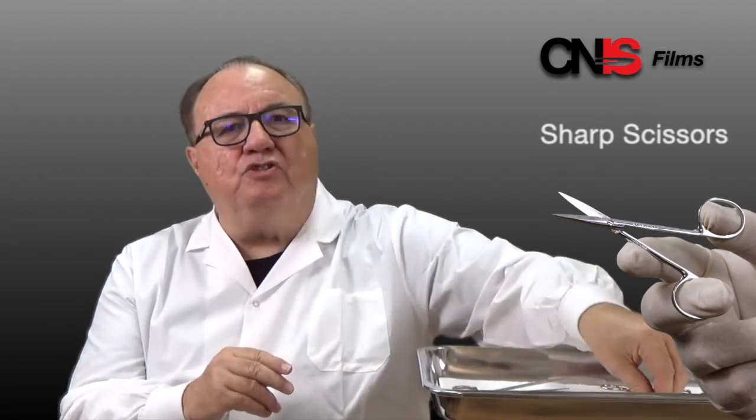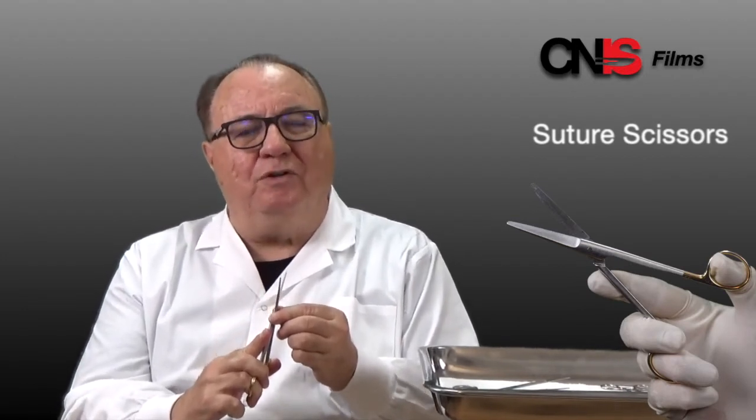Neophytes often refer to surgical instruments as scissors. They aren't all scissors, but we do use scissors. This is the dissecting scissor, or Mezenbaum scissor. There is the sharp scissor which is used for dense tissue, and then there is the suture scissor which is used to cut the sutures. We reserve the suture scissor for the sutures so that the other scissors remain sharp.